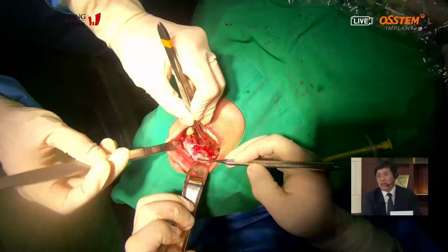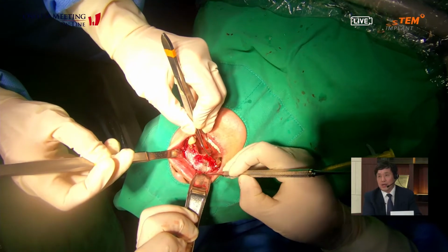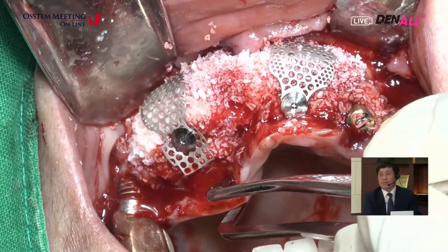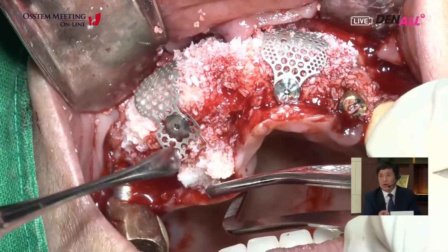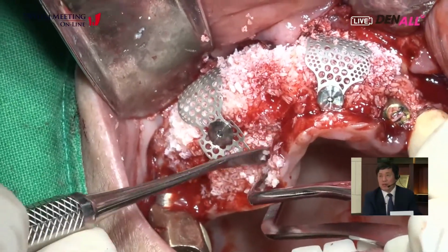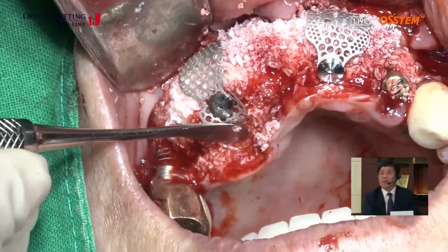Bovine bone on the palatal side for maintenance of the volume. You can see the right canine area, the Ossbuilder has the wing on the palatal side also. Usually for palatal side augmentation, xenogenic bone graft material, bovine bone.